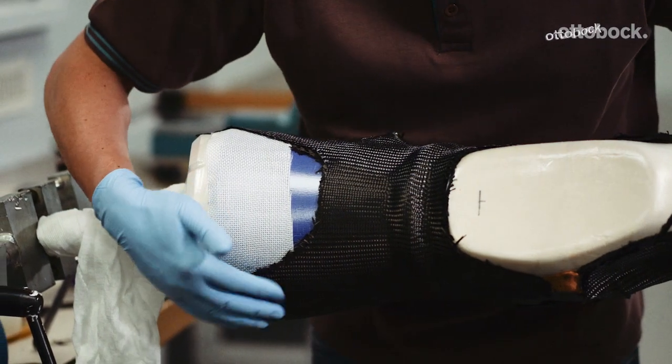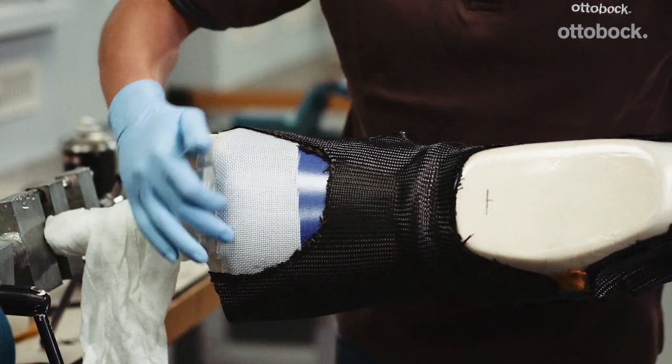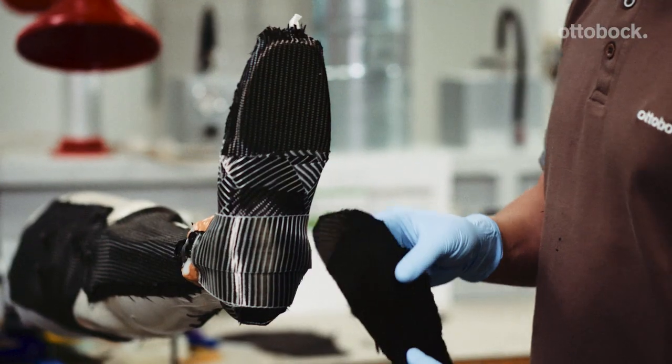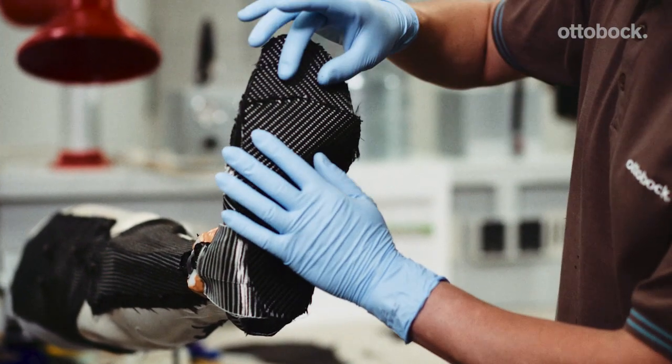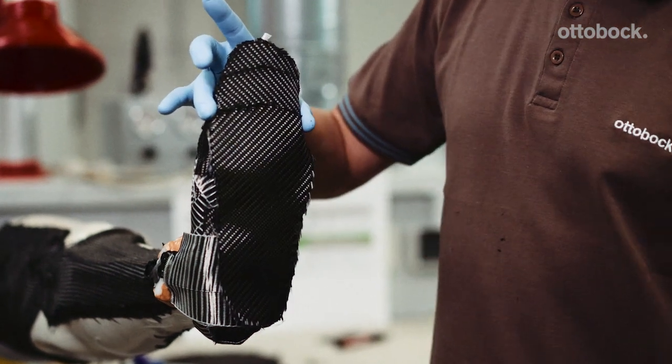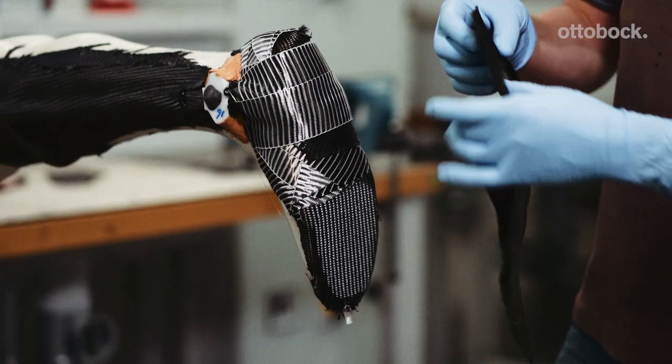If there are no plans to include a final cosmetic layer, the last Orthopox carbon layer should cover the Orthopox cloth flex on the posterior soft surface. If there are plans to stiffen the forefoot, layers with a 90 degree fiber direction should be applied. Choose the number of layers depending on the desired forefoot stiffness.